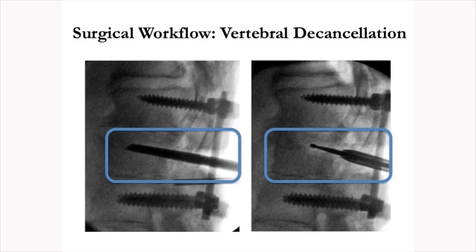The nerve root and thecal sac are medialized, and the PLL incised, and the posterior vertebral wall is pushed into the osteotomy defect using reverse angled curettes and removed, thus eliminating any potential for ventral compression following osteotomy closure. Harvested bone is saved for later fusion.